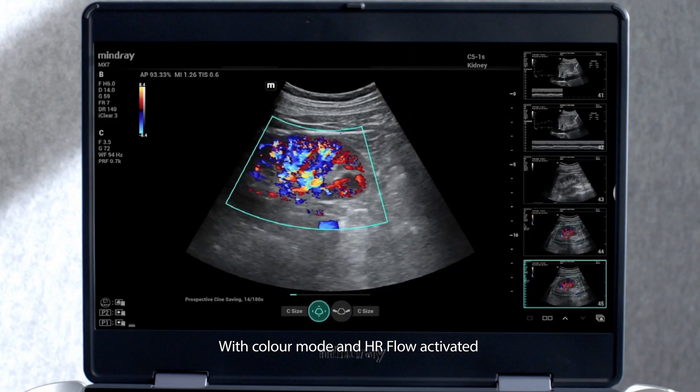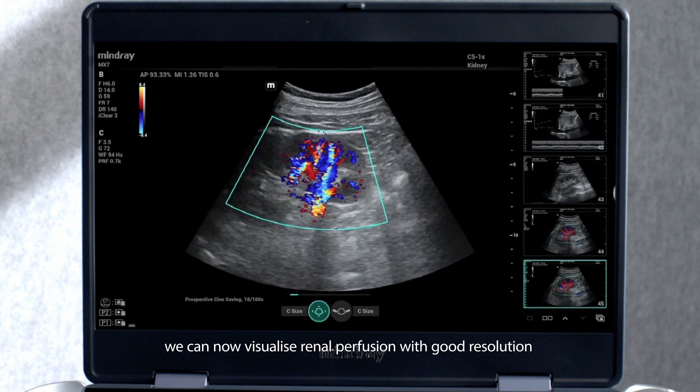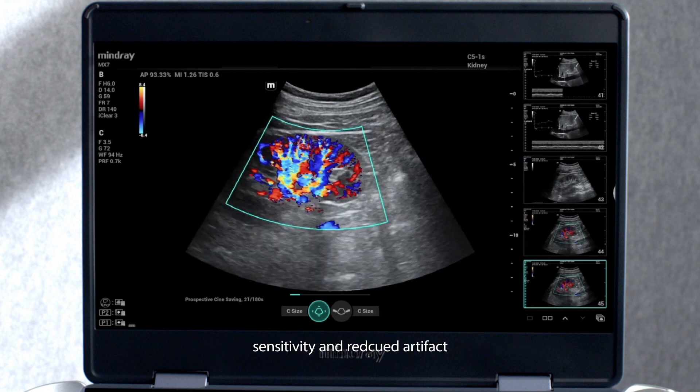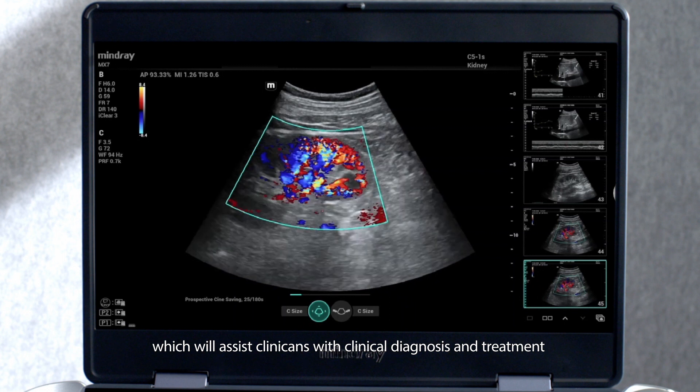With colour mode and high-resolution flow activated, we can now visualise renal perfusion with good resolution, sensitivity and reduced artefact, which will assist clinicians with clinical diagnosis and treatment.